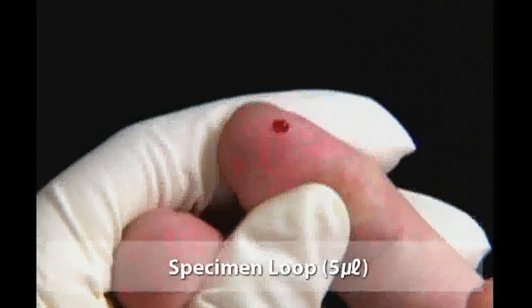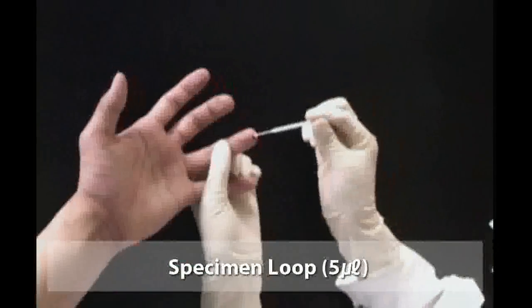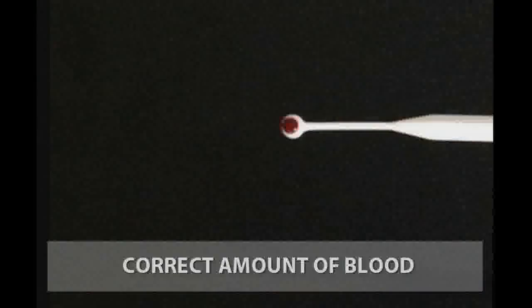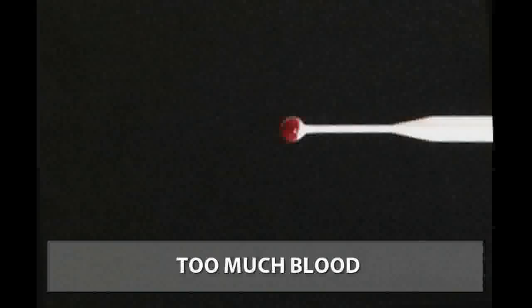As the blood bubbles up, take a disposable specimen loop and dip the circular end of the loop into the blood specimen. The amount of blood collection is critical. This is the correct amount of blood. It is too little. It is too much.